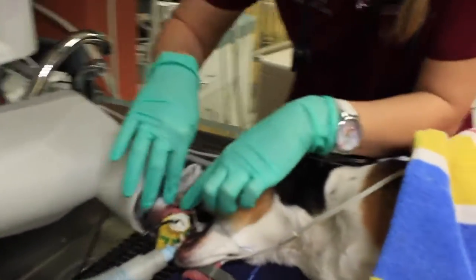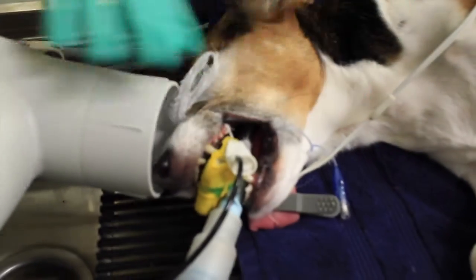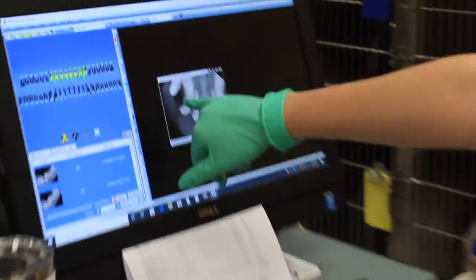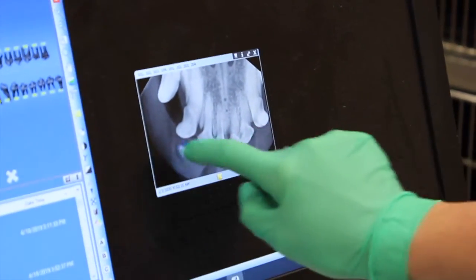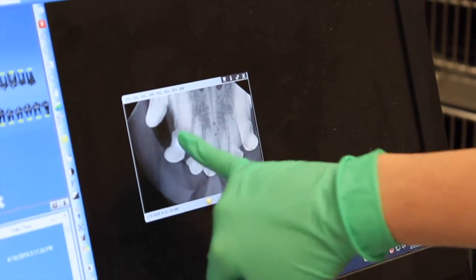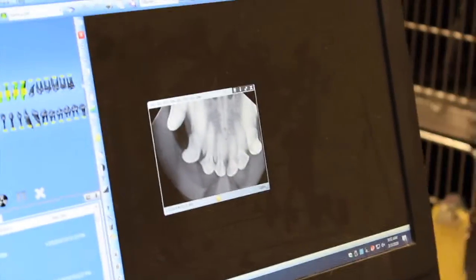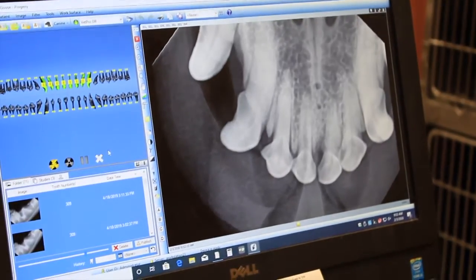My goal is to get all the way from this canine to that canine. This is the probe or the plate, and this is the dental x-ray machine — just like a human dental x-ray machine would look. Here's a picture. I didn't get all the teeth I was looking for — here are six front teeth and I wanted to see the root. I got the root of the majority of these. I didn't get my canines but I got the six incisors, so I'm going to move down the side and I'll be able to get what I missed that way too.